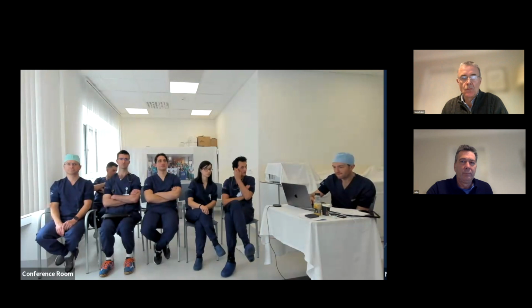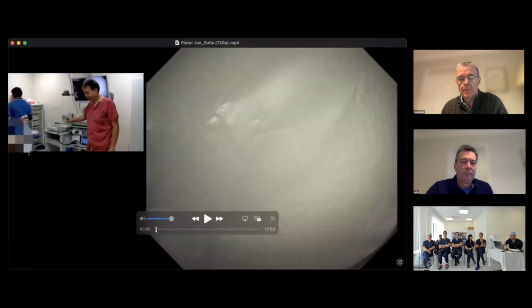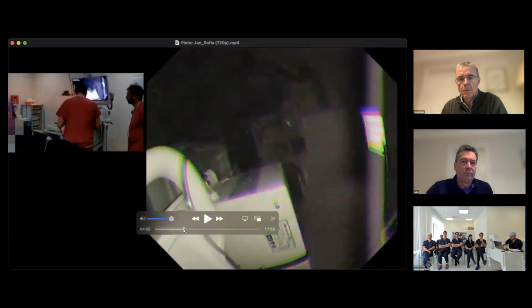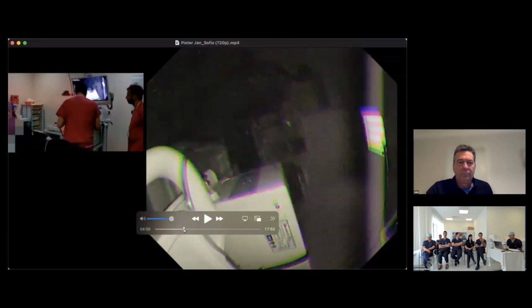It was a video of a gastroscopy, and especially also the preparation of the gastroscopy. That was what struck me maybe the most, or what I liked the most about the video: I think you took about 5 to 7 minutes just talking to the patient, explaining what you're going to do and what you're going to feel, that she shouldn't worry and everything. And I really liked that. Also, as was explained yesterday, checking the scope very nicely, making the tip bend before entering.